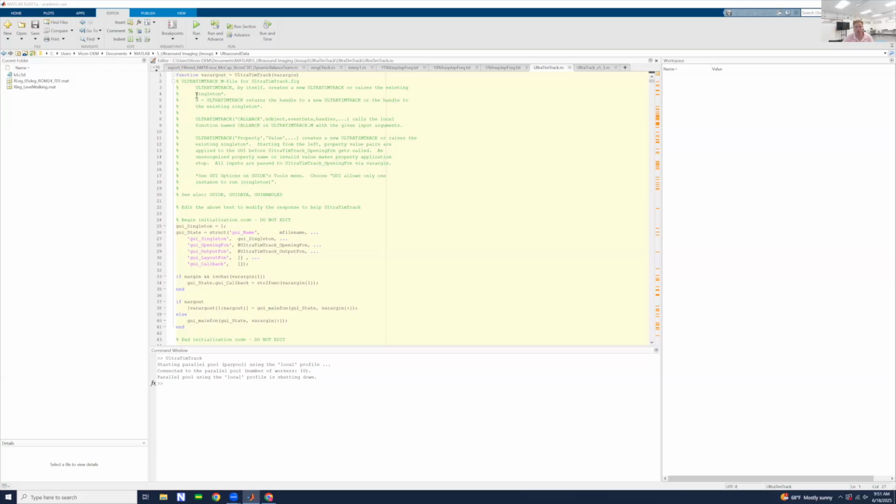That's something that Tim and I are working through at the moment, so that we can just have everything in one software that can handle whatever movement you're interested in tracking. But at least for now, we can quite easily use this other software. And again, it's really good for slower, controlled movements like those in a dynamometer, or movements like a Nordic hamstring curl, or maybe even a sit to stand. So the video that we'll track in this software is just from slow passive rotations of the ankle joint in a dynamometer.